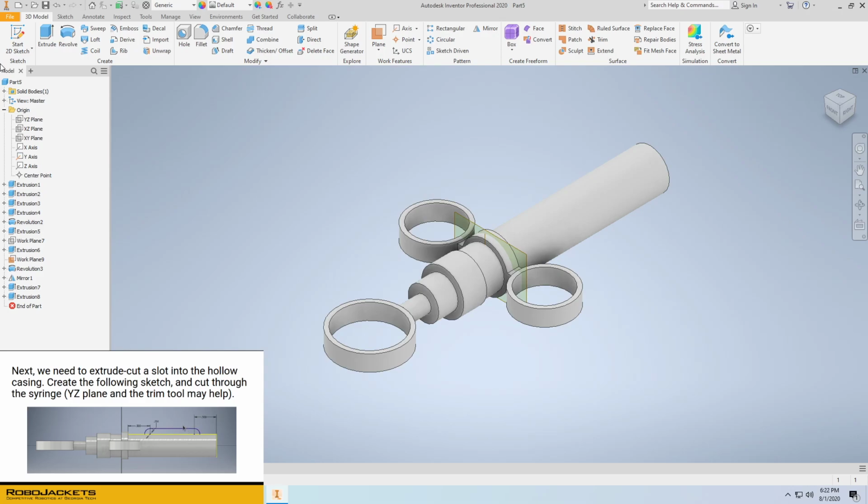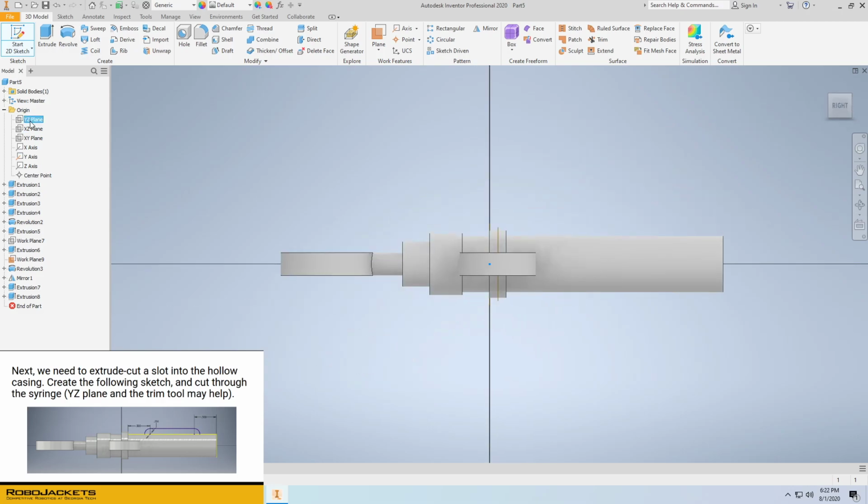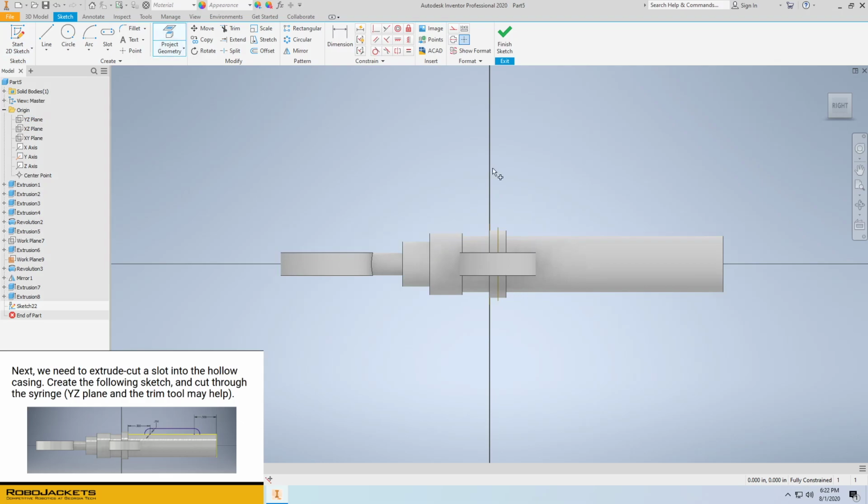Now we want to extrude a slot out of our hollow cylinder. To do that, let's go ahead and start a new 2D sketch on the YZ plane. We're going to want the geometry for the stop point, a stop point up here, and the line itself. Go ahead and use a 3-point slot, placing one point on the outer diameter, the other point on the outer diameter as well, being careful not to get the inner diameter, right? Outer diameter, and making it main thick. There we go.